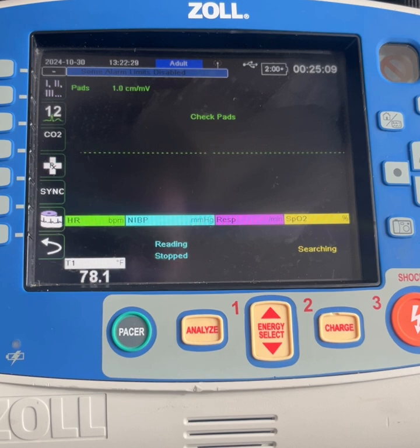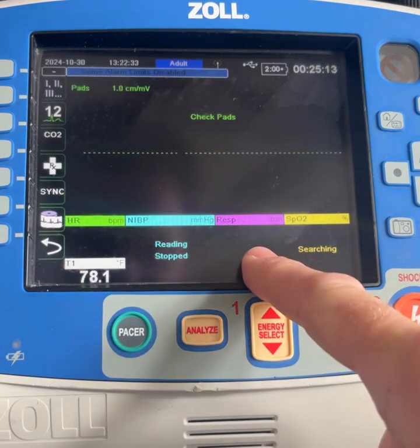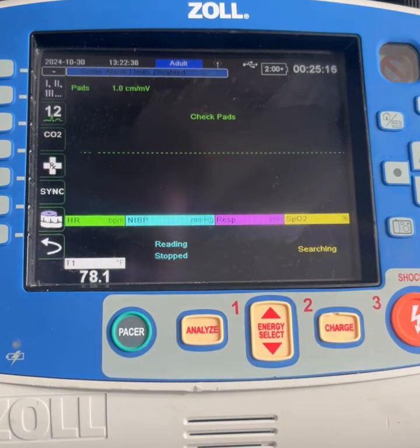When your monitor gets turned on, by default, this section right here, where it says RESP, should say RESP OFF.